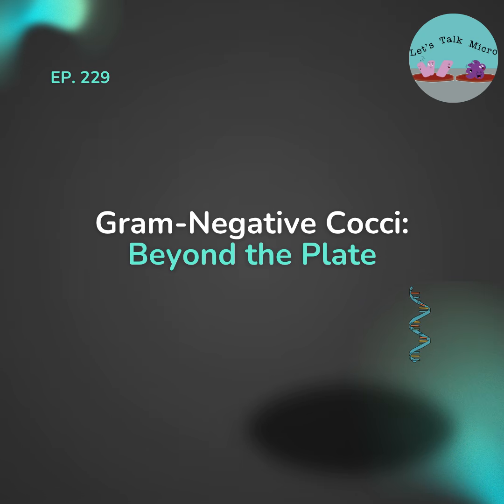So let's go ahead and talk about tests or instruments and identifying methods that take longer. So of course you have your classic VITEK NH card. It identifies Neisseria gonorrhoeae, meningitidis, lactamica, cinerea, and Moraxella catarrhalis. And those of you that work in the lab know that one of the drawbacks of this card, compared to other methods, is that it requires a larger amount of organism. And we have talked about this in the podcast before. For this card, you need a suspension of 2.7 to 3.3 McFarland standard.